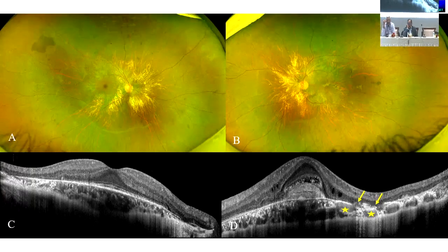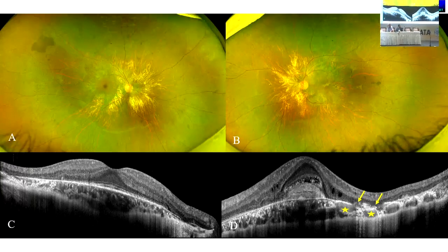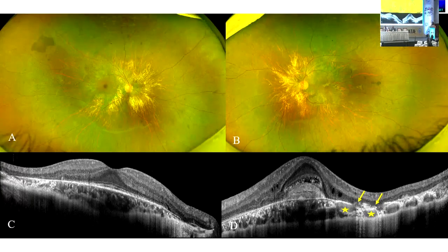I think an electrodiagnostic test would have been... It also didn't pick up anything significant. The ERG is normal or...? I wouldn't expect it to be normal because in the right eye, if you see, there is one area of spared foveal RPE. Surrounded by that, there is an area of atrophy. Because the fovea is kind of spared in the right eye. Left eye, of course, there is something else going on. So I'm not too sure if this patient has choroideremia or if that's mid-peripheral pigmentary changes.